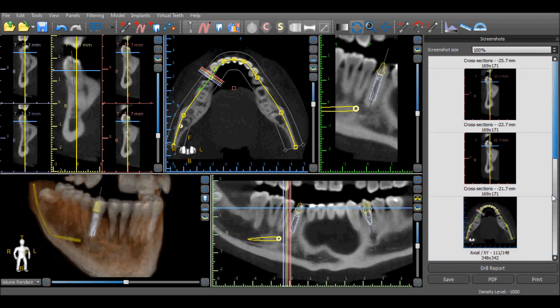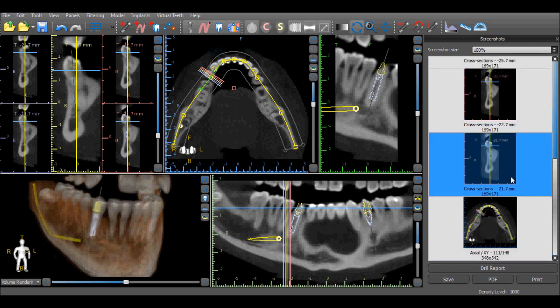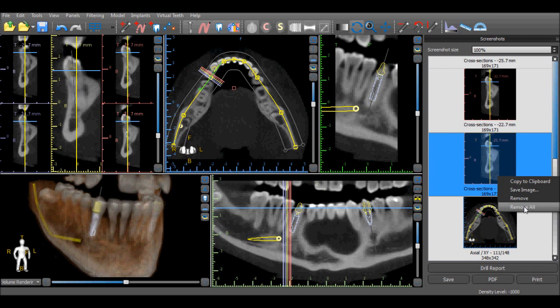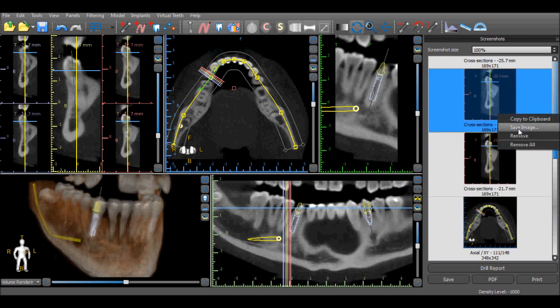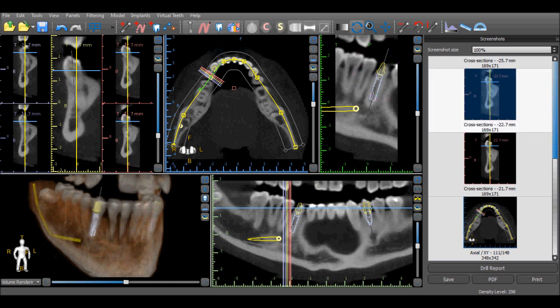Images can be removed from the basket by selecting an image, right-clicking and choosing Remove. All the images can be removed by selecting the Remove All option. Any particular image can be saved or copied to the clipboard. In addition, all the images in the screenshot basket can be saved by clicking the Save button.